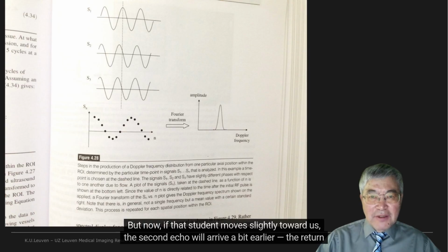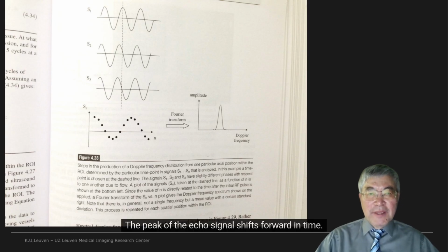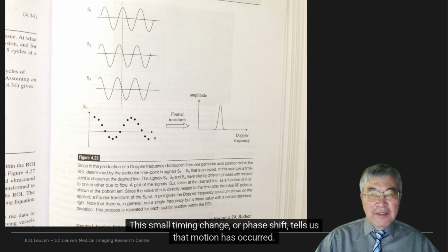But now, if that student moves slightly toward us, the second echo will arrive a bit earlier. The return time becomes shorter. The peak of the echo signal shifts forward in time. This small timing change or phase shift tells us that motion has occurred.